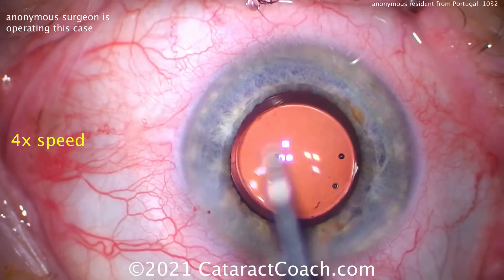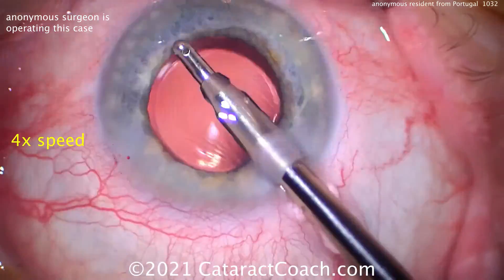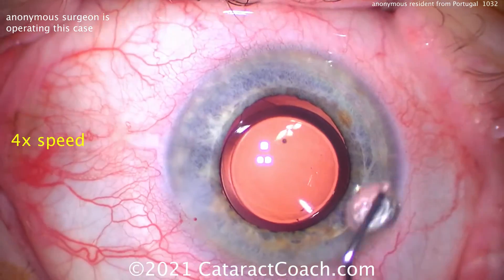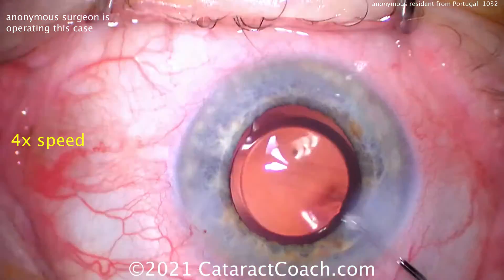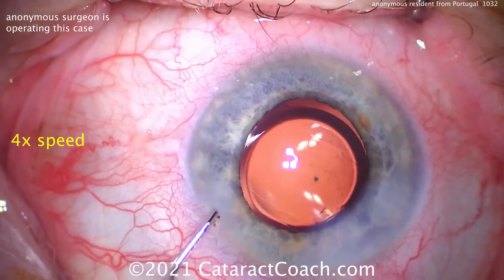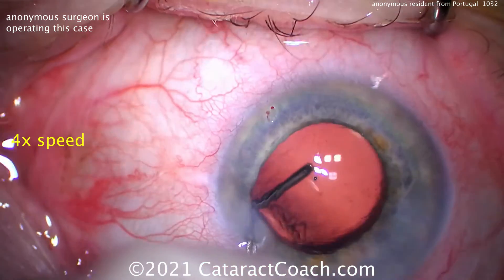Let's clear out the viscoelastic — are we going to go behind the lens or not? Cleaning out the AC. At case number 70, you don't necessarily have to go behind the lens. Hydrate the incision — clean that up. Yeah, that incision needs work, and you're doing the hydration the wrong way. You need to watch some Cataract Coach videos. Fix your incision, fix that hydration — the rest we'll work on.